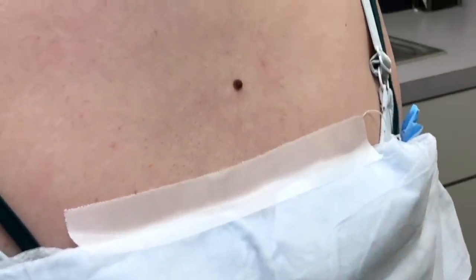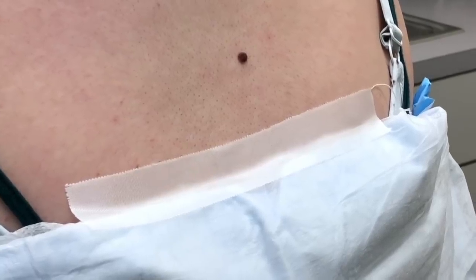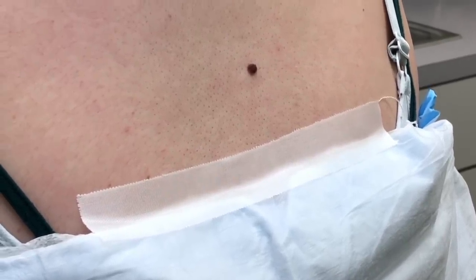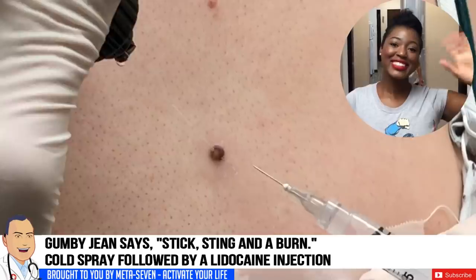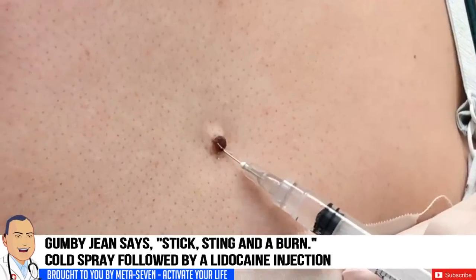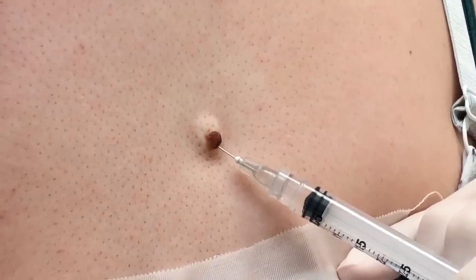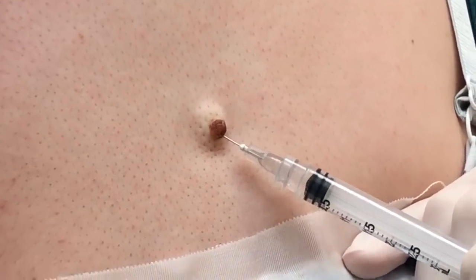And has it ever bled or changed recently or anything like that? No. Okay, so you want us to remove this for you, correct? Yes. What you're going to feel: stick, sting, gonna burn. Here it comes. Little stick. Sting. You feeling the sting and a burn? Good. Nice and slow. We'll take it slow.